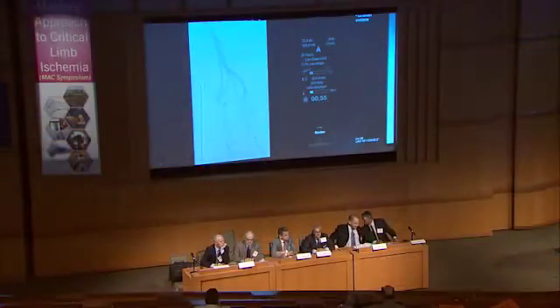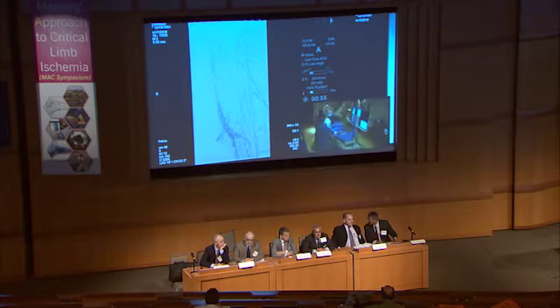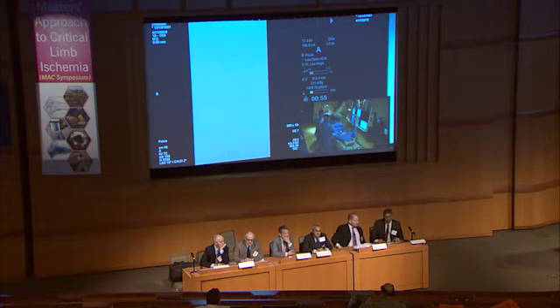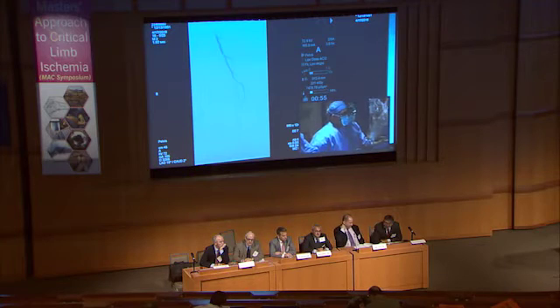And what would be of additional interest at the end, now you can see there are multiple fistulas also originating from the deep femoral artery, which could be expected if we consider this as an AV malformation. So of course this raises the concern that more flow will be directed into the deep femoral artery, resulting in reduced flow into the stent graft. But on the other hand, I don't see another option, because we have already seen a lot of fistulas coming from the SFA, so we need to treat those as well.